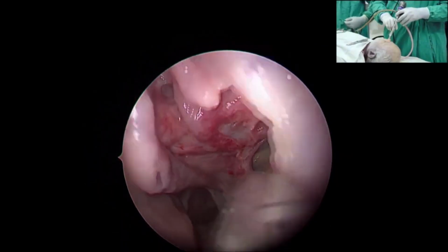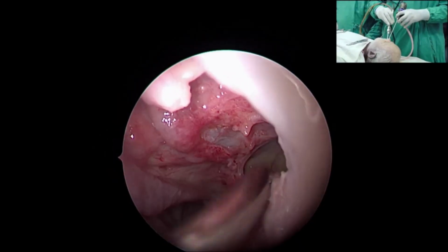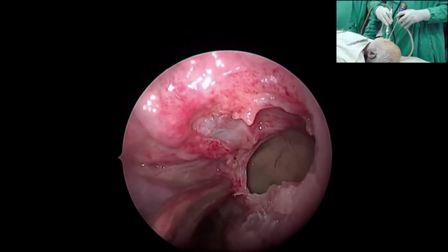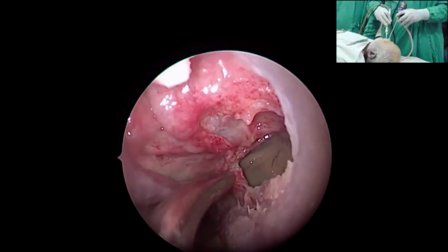So I can enlarge this medial wall posteriorly and flush this till the posterior wall to give a mega middle meatal antrostomy, you know. So that is horizontally a mega middle meatal antrostomy. If I want further, with more gravitational drainage, I can flush it till the floor of the nose.